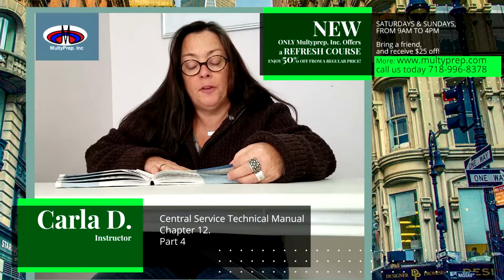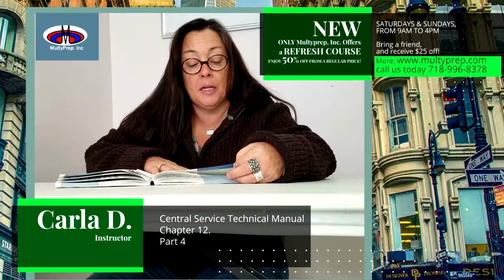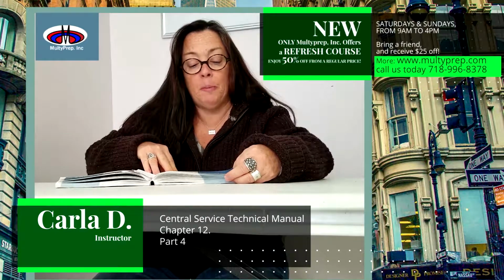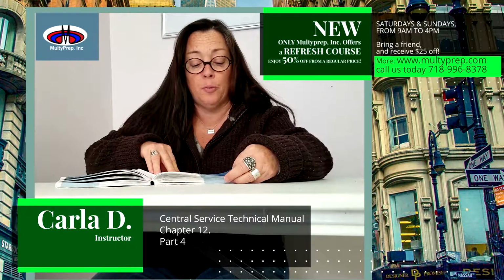Instrument tips should always face the plastic side of the package to avoid penetrating the paper side and contaminating the contents. Hinged instruments must be packaged in a manner to keep the instruments open for sterilization. This can be accomplished by using commercially purchased products.